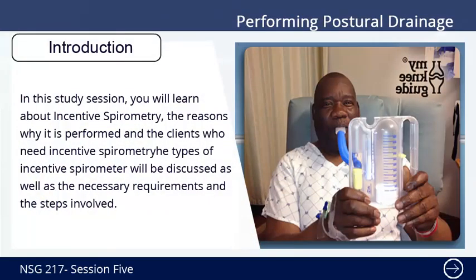Introduction. Incentive spirometry is a method of deep breathing that provides visual feedback to encourage the client to inhale slowly and deeply to maximize lung inflation and prevent or reduce atelectasis. It is also referred to as sustained maximal inspiration.